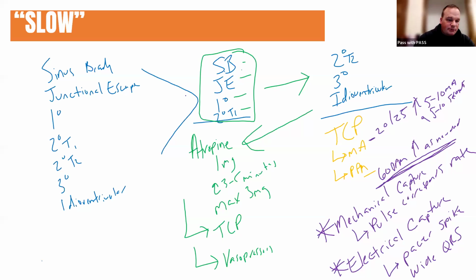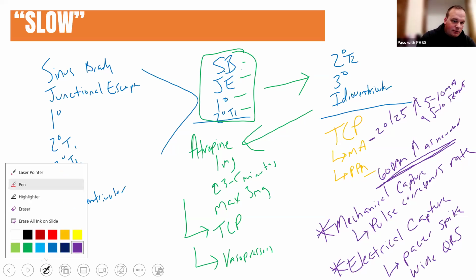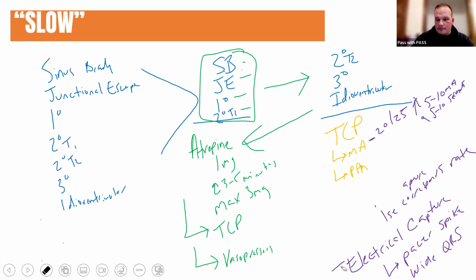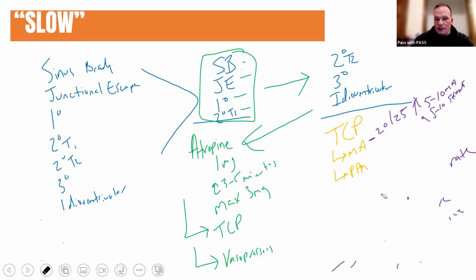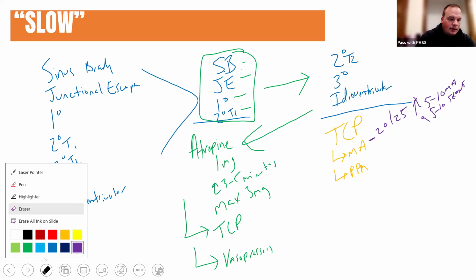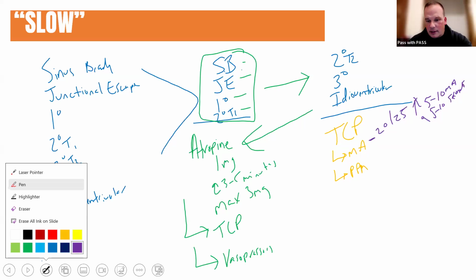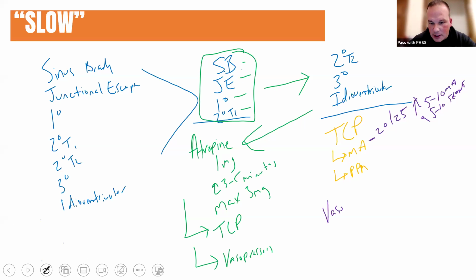Once we set up our pacemaker, if it doesn't work, then I'm going to erase this, and again, remember it's recorded, and I'll throw up the recording so you can go back and watch it. So if my pacing doesn't work, or for some reason it's inadequate, I can't get good electrical and mechanical capture, then we are going to go to vasopressors. Okay, so that's kind of our last ditch effort. That's us dropping back to punt. This is when we're going to do our vasopressors.